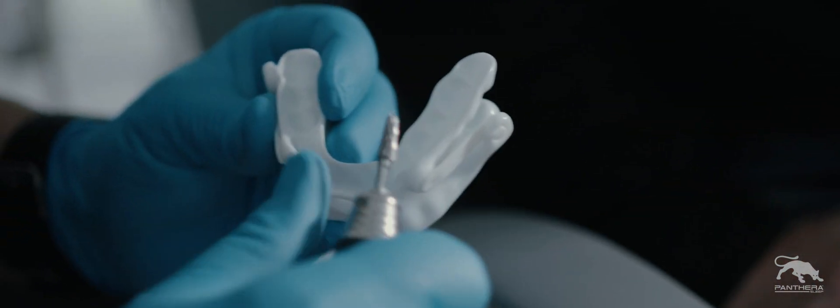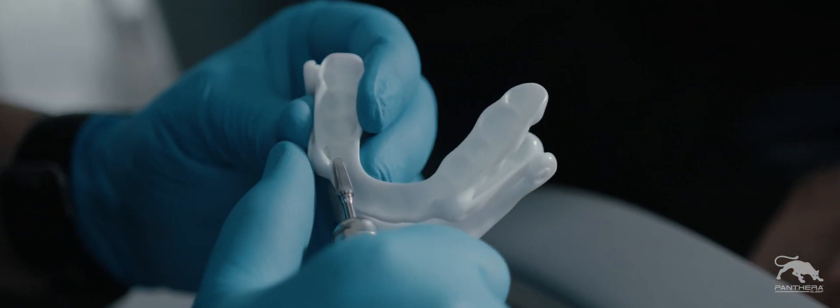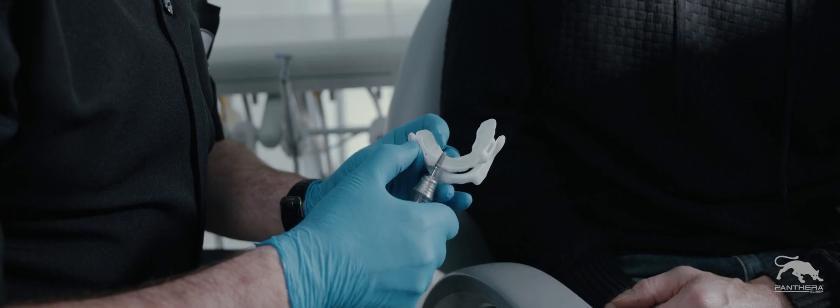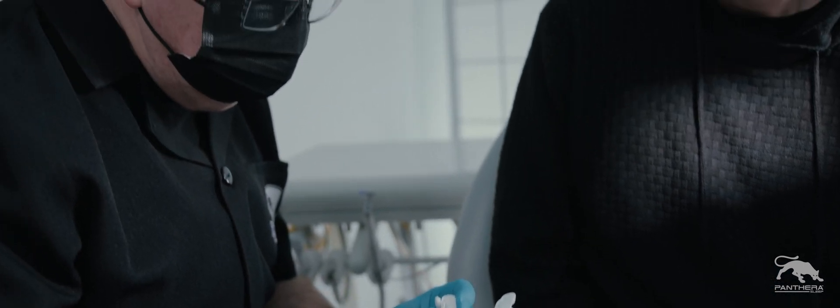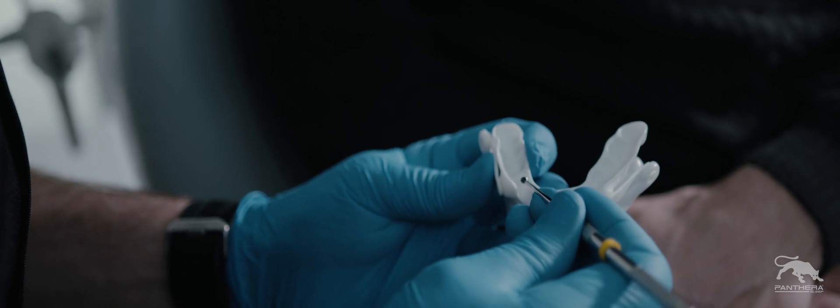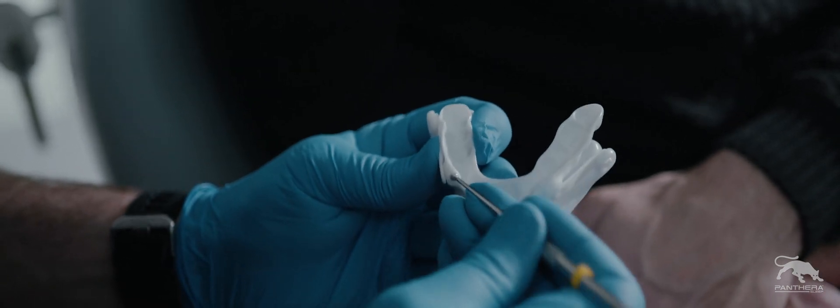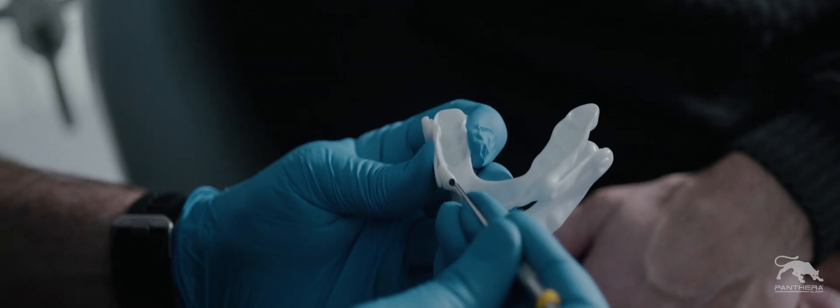Using the carbide burr, gently remove thin layers of nylon at the targeted areas. The inside of the splint should not be polished, just use a lecron to remove any residual material.